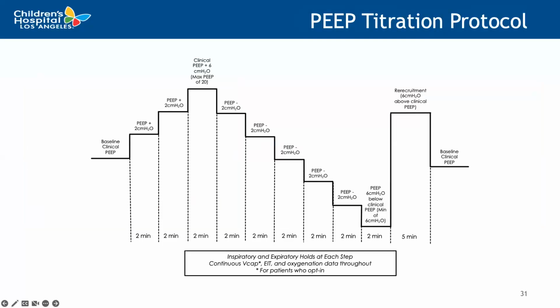And so here's a schematic of our PEEP titration that we are doing at the bedside. This is our research protocol, but I really do think this is a viable strategy for any respiratory therapist or provider on the call when assessing patients at the bedside. And most notably, I want to point out that I think it's really important that providers do a recruitment maneuver, for the reasons that I mentioned earlier, prior to doing any decremental PEEP titration.